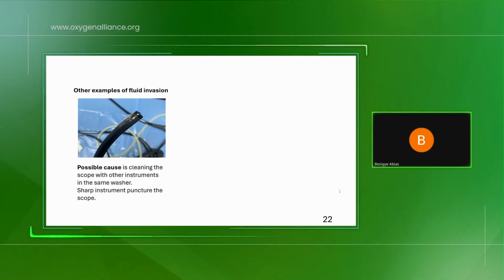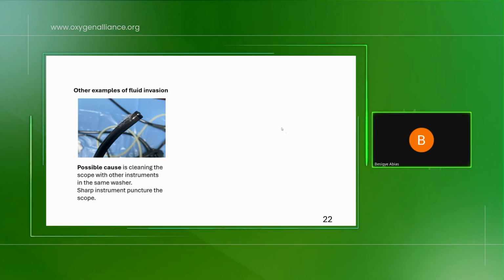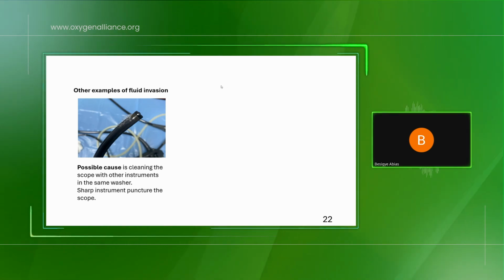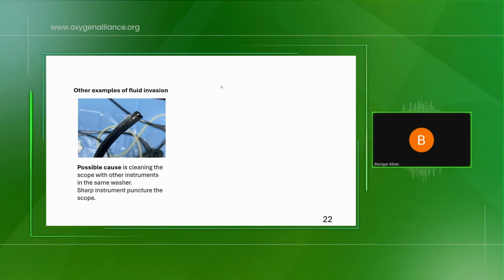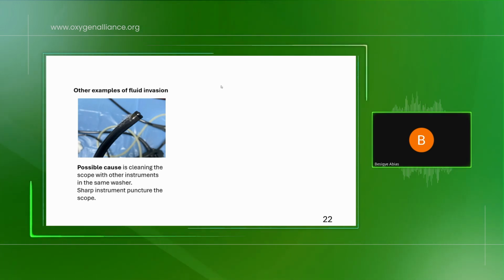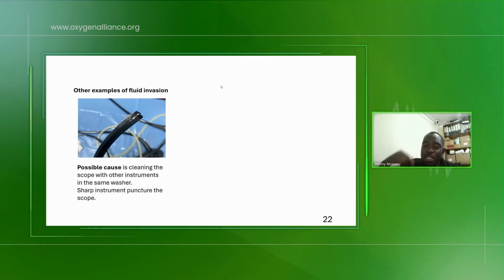Yes, I can. Now, I have a client who happens to have an endoscopy machine, an AVC XR light source, which is Olympus. And he needs a light control cable. Is it possible to get a light control cable? Is that for the rigid scopes or the flexible ones?